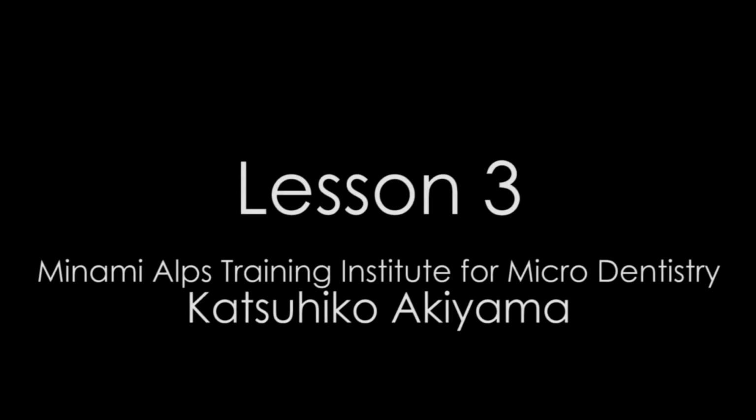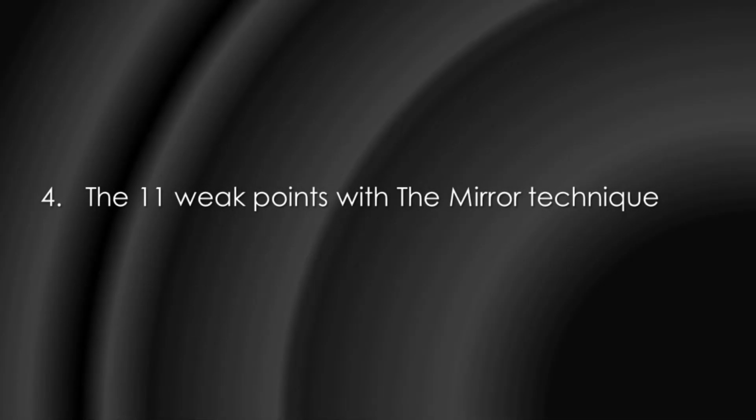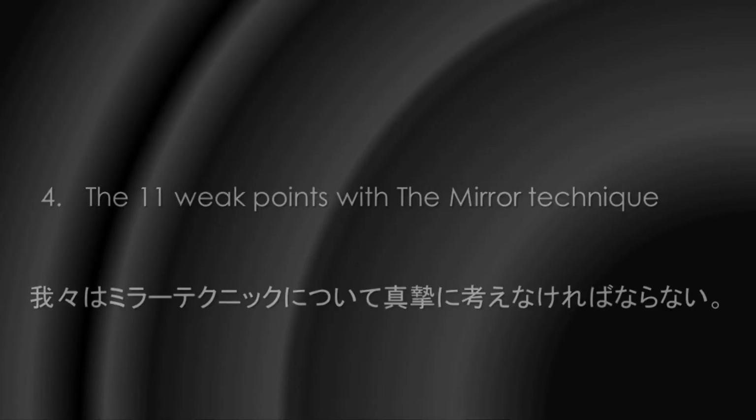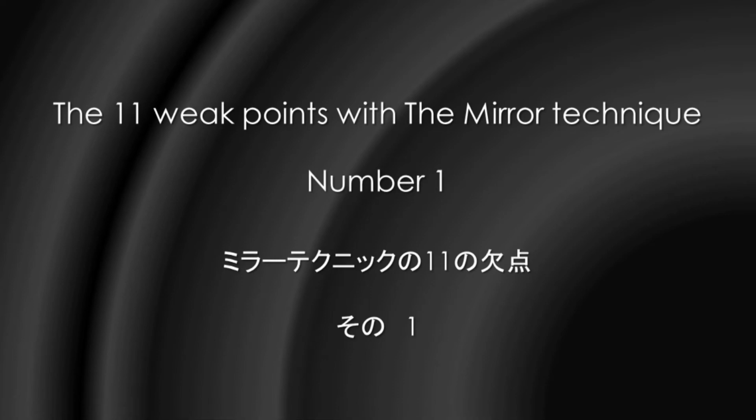Lesson 3. The 11 weak points with the mirror technique. We have to think about the movement of the mirror view technique. The 11 weak points with the mirror technique.